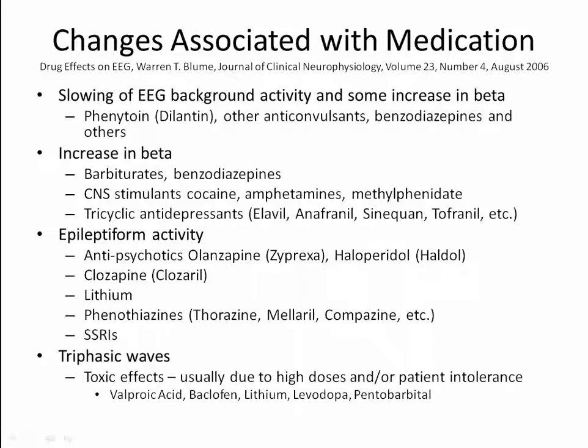When you're talking to an electroencephalographer or a neurologist, it's generally their description of the way the EEG behaves, and their terminology can be somewhat different than what we use in the neurofeedback field. For example, a neurologist would be looking at an EEG tracing, and they would be interested in the background activity, which is just the activity that's happening generally, and then any activity that emerges from the background activity is of interest.